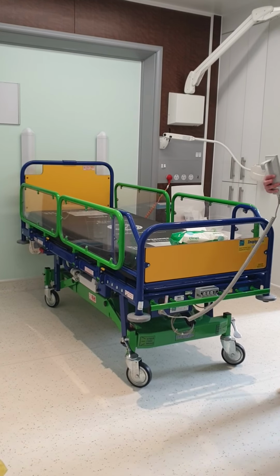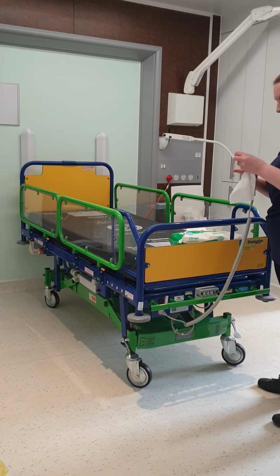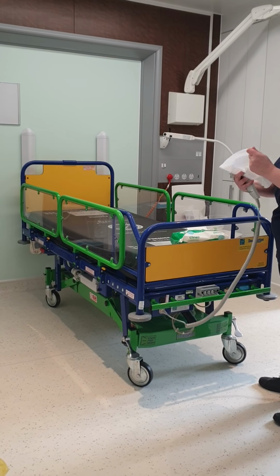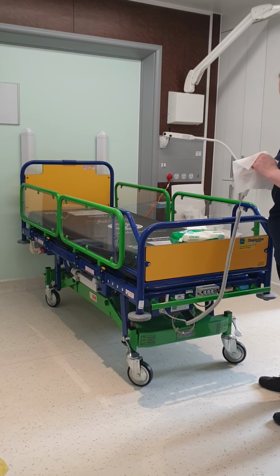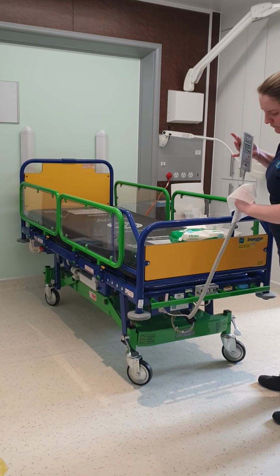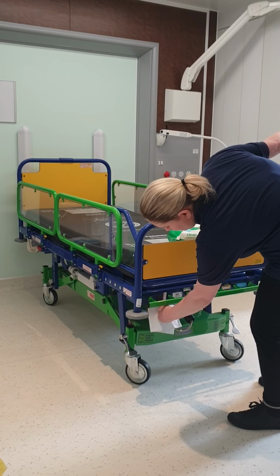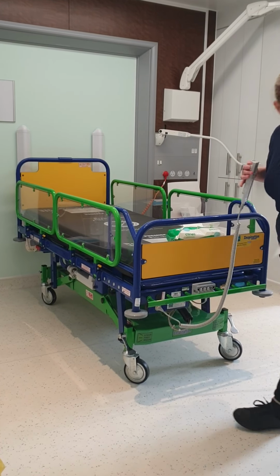The most important thing is to be systematic. So know what order you're going to clean things in and make sure you don't forget anything. Although some of these surfaces are quite complicated to clean, just always keep in mind the five key principles.